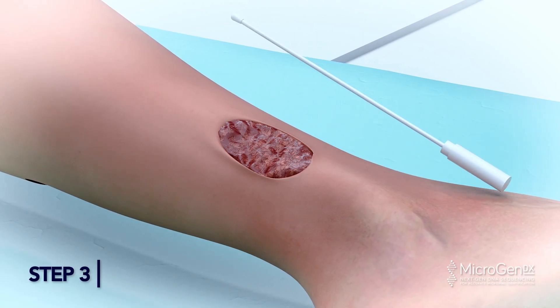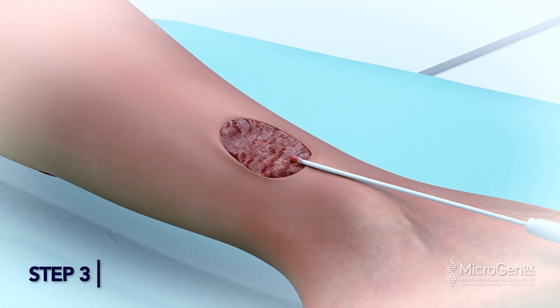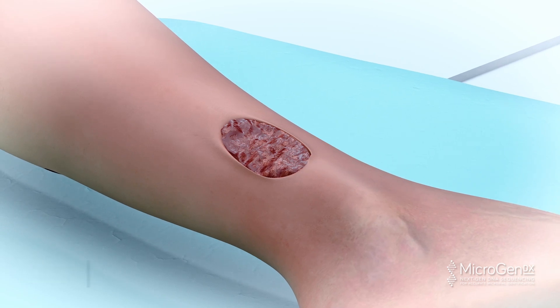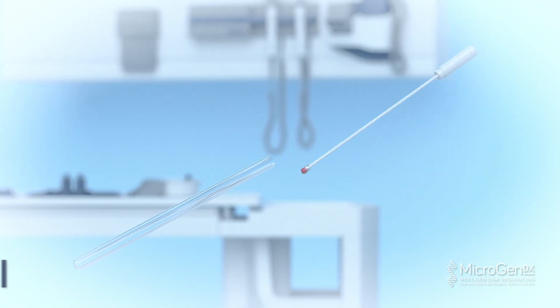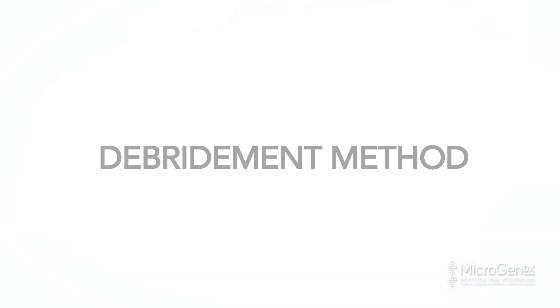Step 3: Roll the swab over the entire surface area of the wound, applying pressure as it moves across the wound. Get as much material on the swab as possible to ensure a conclusive sample. Step 4: Insert swab into specimen tube and seal tightly.